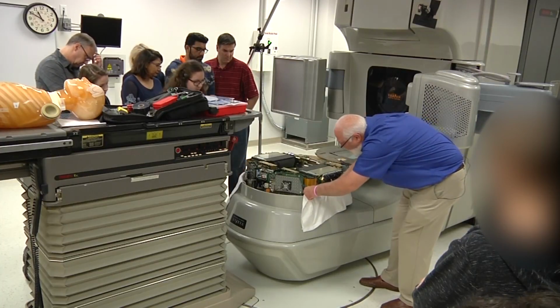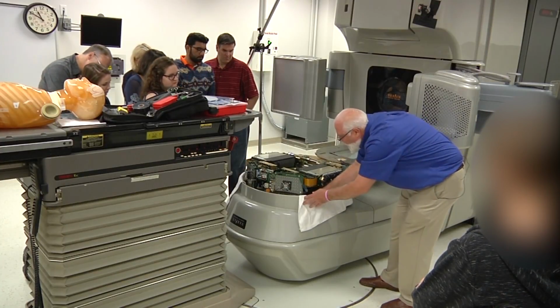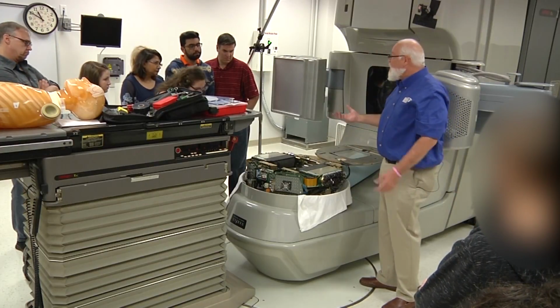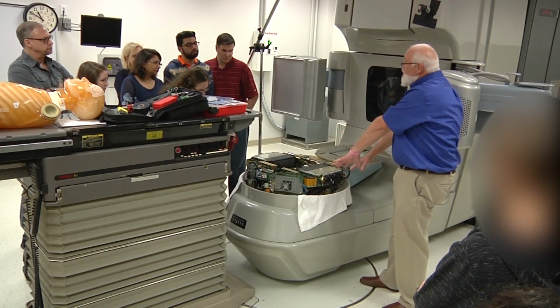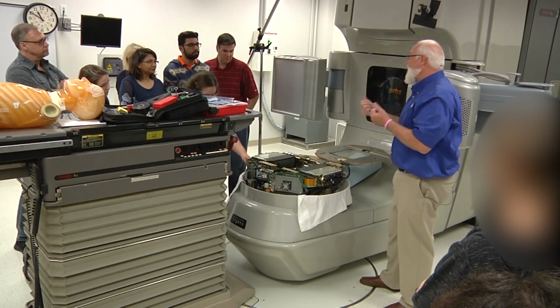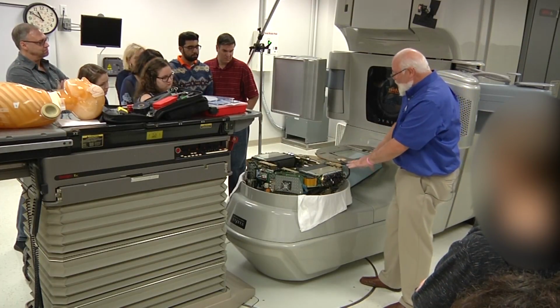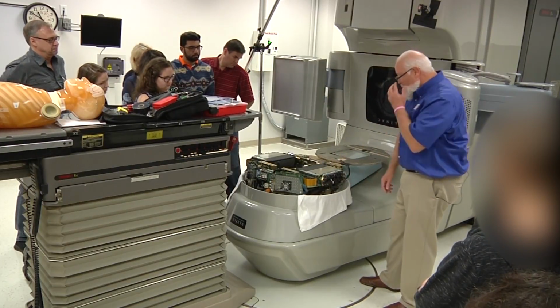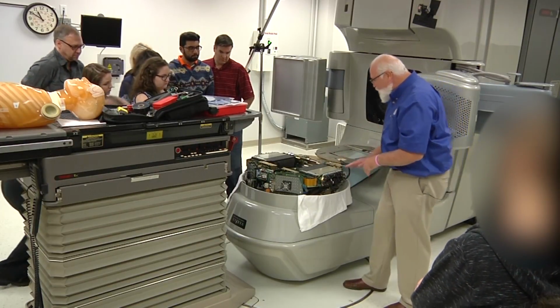And then, if there's more than one person in the room, you want to communicate to the other therapist that you've got your hands in there. You shouldn't have the pendant in their hands. You don't want to move any of the jaws while your fingers are in there. So it's just a precaution.